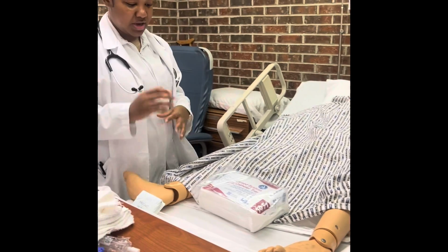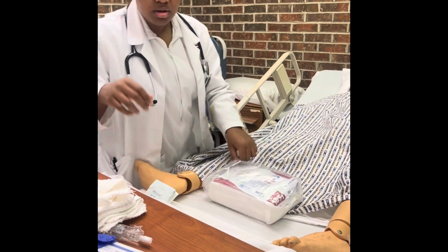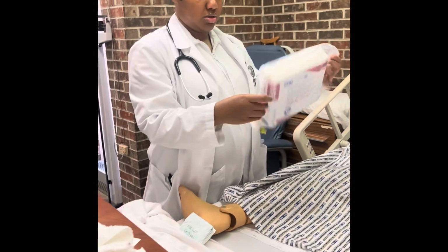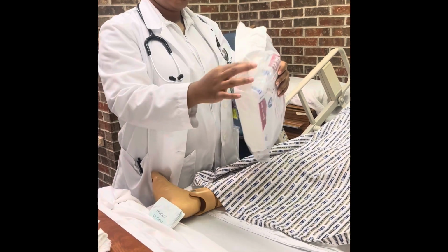So first I'm going to wash my hands. I can put on a clean pair of gloves. I'm not going to though. No, first I'm going to open up my foley kit to get started. Wash my hands, open up my foley kit.